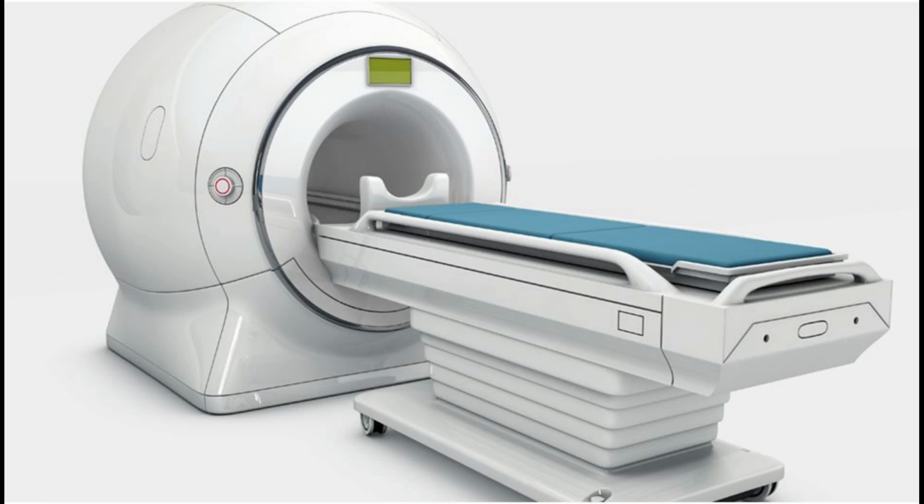Magnetic resonance angiography, MRA, generates pictures of the arteries to evaluate them for stenosis, abnormal narrowing, or aneurysms, vessel wall dilatations, at risk of rupture. MRA is often used to evaluate the arteries of the neck and brain, the thoracic and abdominal aorta, the renal arteries, and the legs, called a runoff.